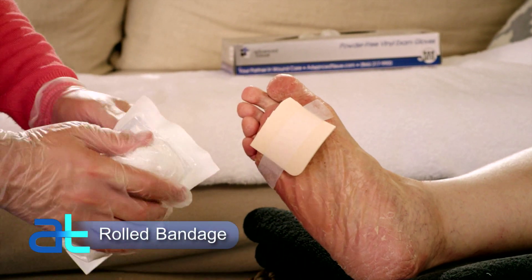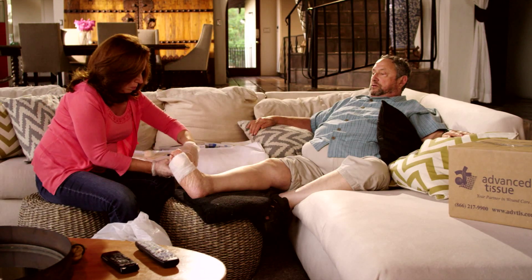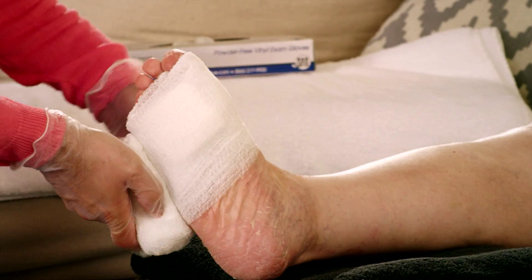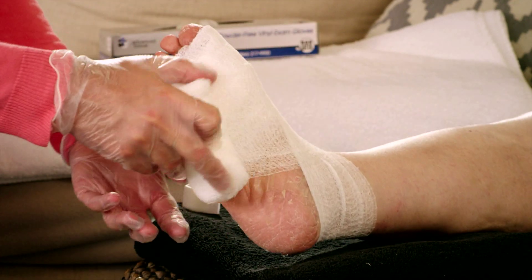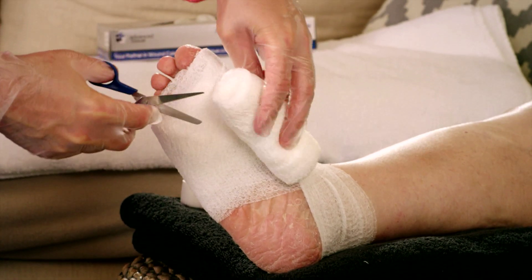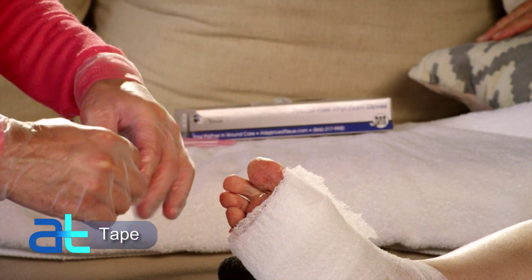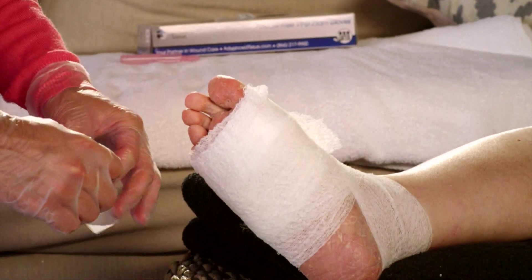Next, apply the rolled gauze to secure it. Let me know if this is too tight. The rolled gauze comes off most easily when you unroll the bandage around the extremity and keep a little tension on it as shown. Anchor the bandage to the foot or ankle to keep it from coming unraveled. Continue wrapping the gauze in a circular fashion, overlapping half of the previous layer and smoothing out any wrinkles as you continue wrapping. If the gauze roll is too long, you can cut it. Secure the loose end with tape, but don't put tape directly on the skin unless instructed to by your doctor or nurse.